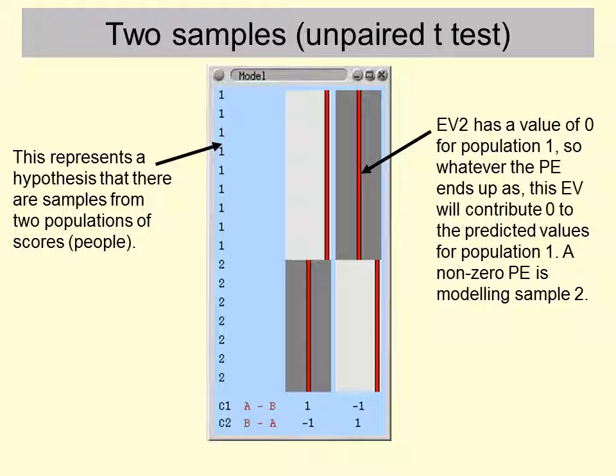And for this second contrast, it's asking, at a particular voxel location, is sample 2 more active on average than sample 1? So if we had a voxel where both populations activate about equally, then of course the result will be 0 in the cope.